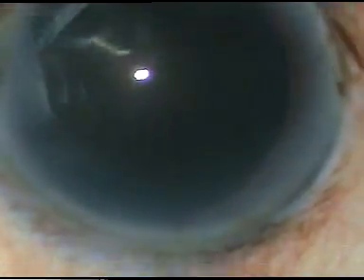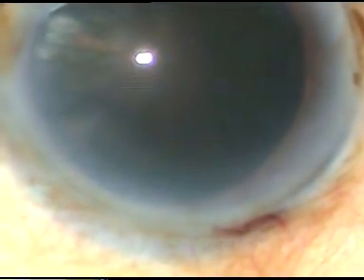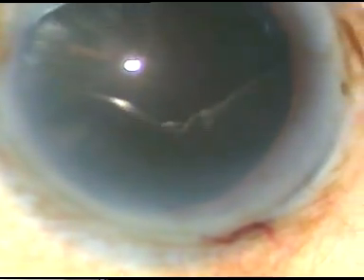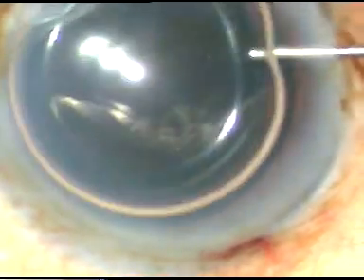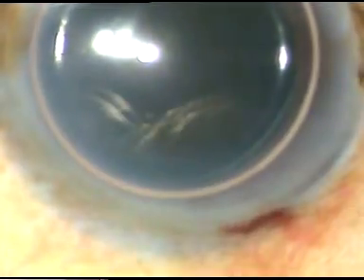This is the main incision. It is a 2.8 mm incision. Now one side port has been made about 3 o'clock hours away from the main incision. The main incision is at around 11 o'clock. Now a big air bubble has been injected into the anterior chamber. This is trypan blue dye.